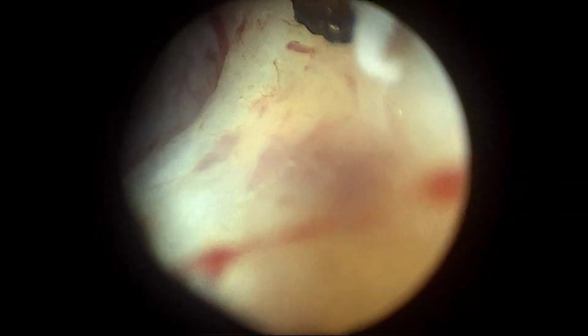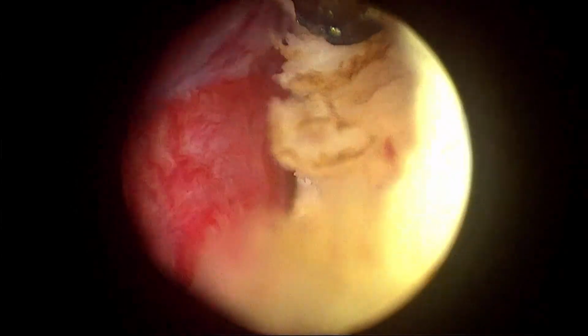Sir, in larger glands with larger resection time, do you see a higher stricture rate, or is there nothing like that? There's no association. If you are not dilating it properly, and if you are using force, then yes. Otherwise, no. Sir, do you use Otis urethrotome or simple dilators for calibration? I don't use a dilator at all.